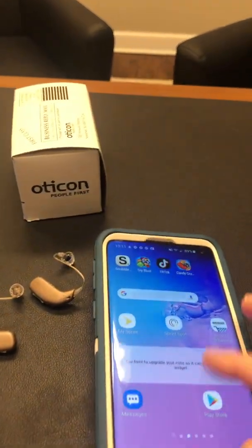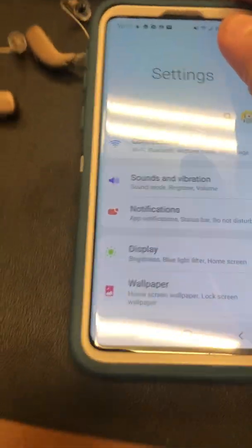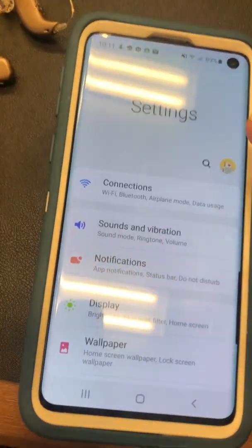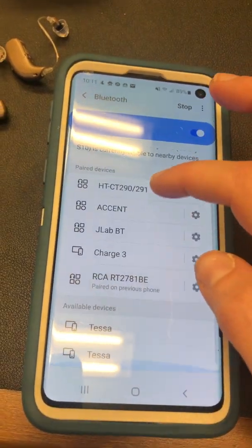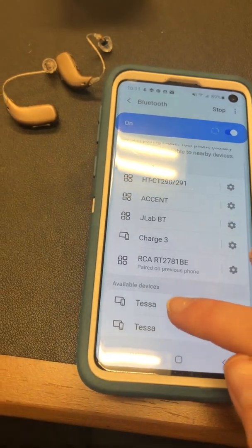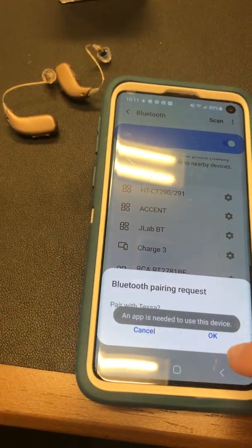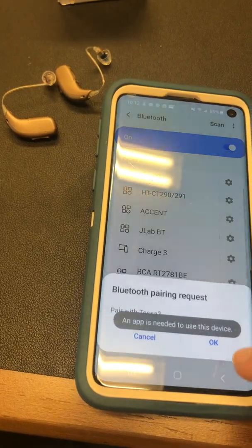Then you're going to go to your settings, find the Bluetooth settings, and scan. The hearing aids will be listed under your name — for me they are under the name Tessa. It will ask you to pair, so you will say okay, and you will do the same thing with the other one.